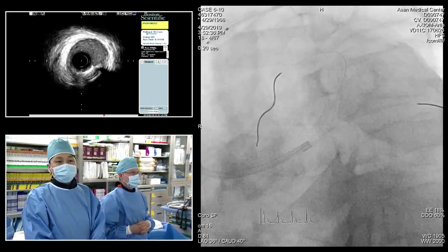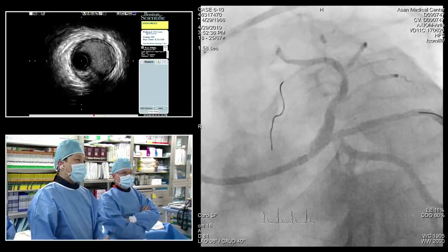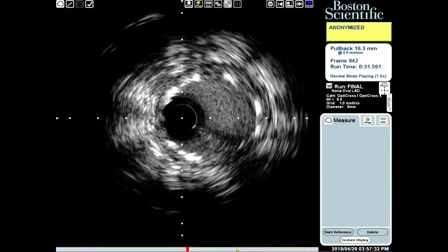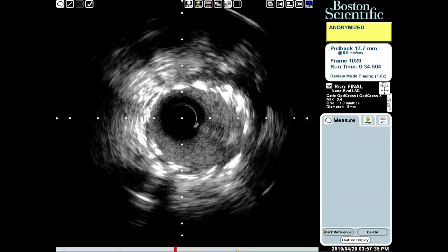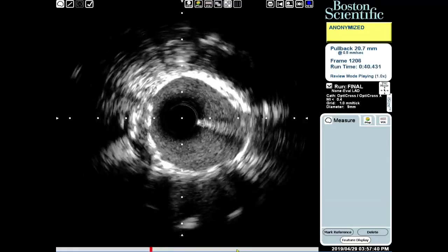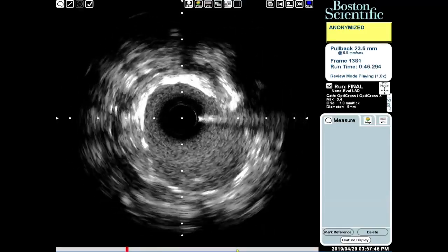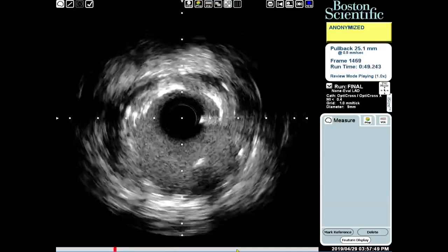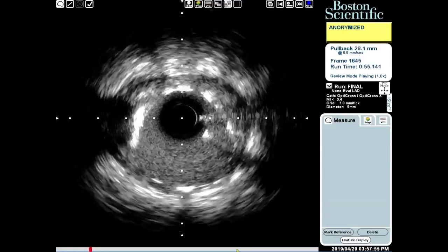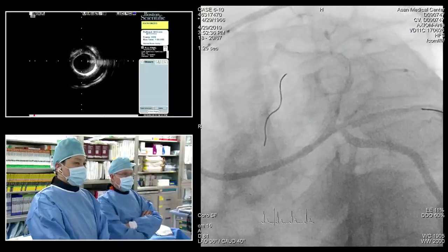Yes. Can you please show? Yes. Okay. This is the LAD pullback after kissing and high pressure balloon. You can see that proximal LAD, distal stent edge is clear, well opposed, and well expanded. And you can see here proximal LAD, circumflex is coming from 6 o'clock, circumflex ostium is very clear. And distal left main, stent is well expanded, up to 4.0 diameter, and this is the proximal edge of the stent. So can you show a couple of pictures?